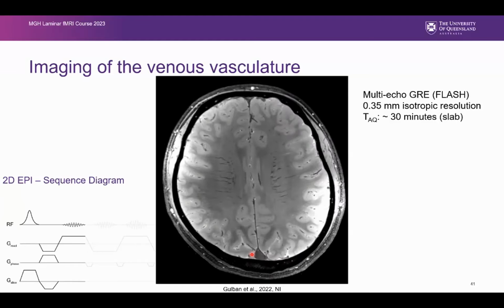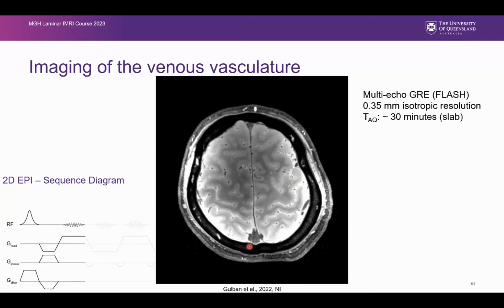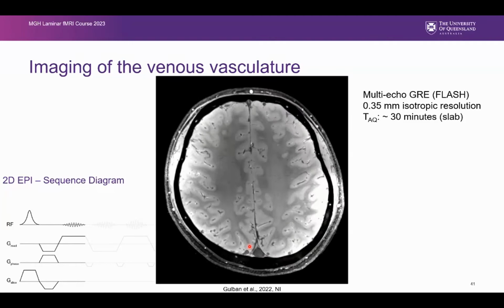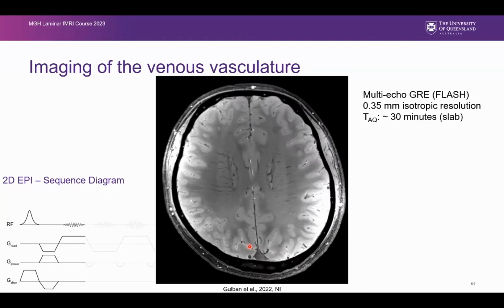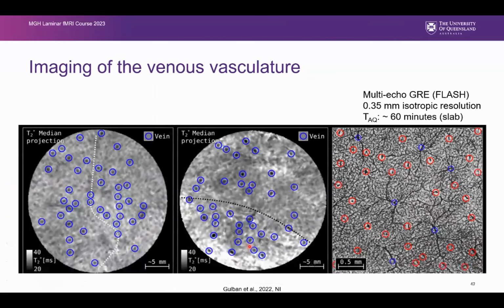And you can also segment these really large veins quite well, which, for example, if you do lots of visual imaging, then you have the transversal sinus at the back. So that could be a problem for you. So I think that is a bit better technique if you think more about processing the data. If you really just want to visualize veins, then SWI is okay if you look for whatever anomalies. But if you start to process the data, it's quite nice.